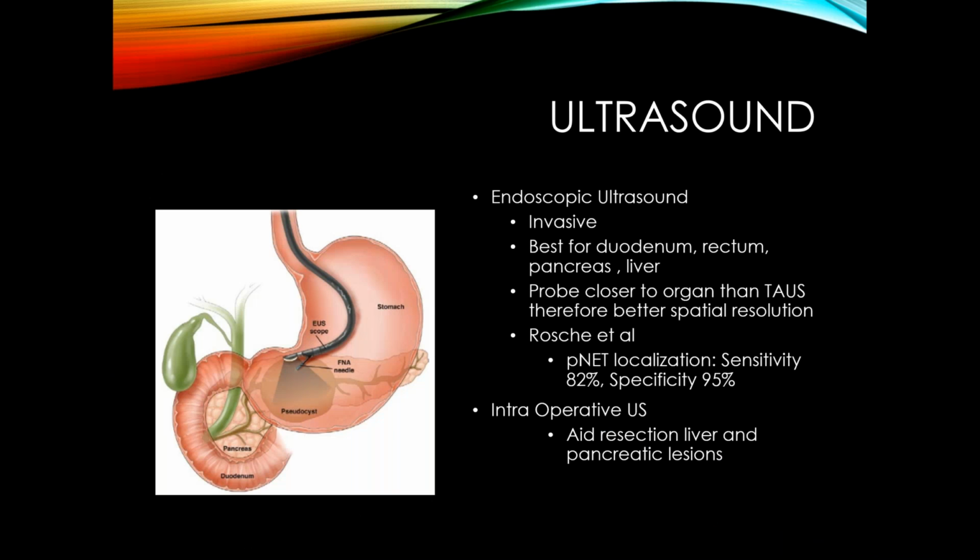Now, there are other uses for ultrasound. You can do endoscopic ultrasound, in which the surgeon or clinician puts in a probe and actually can sample and biopsy the pancreas or duodenal lesions, as well as we can do ultrasounds in the operating room to guide resections.